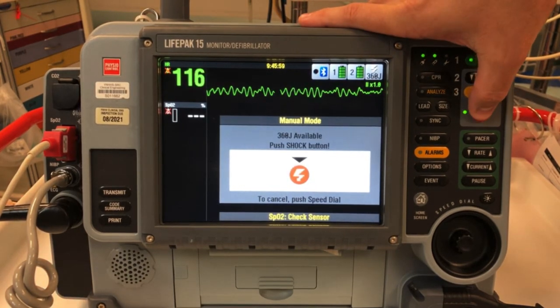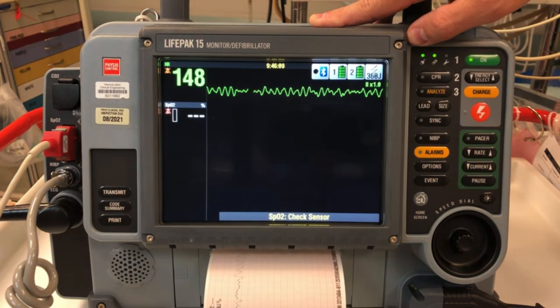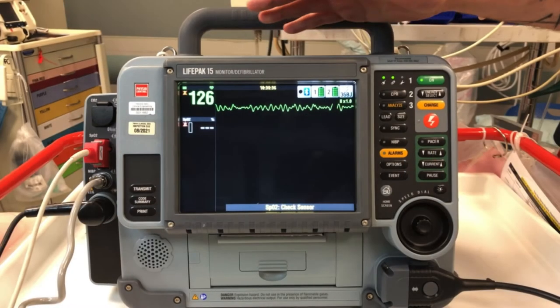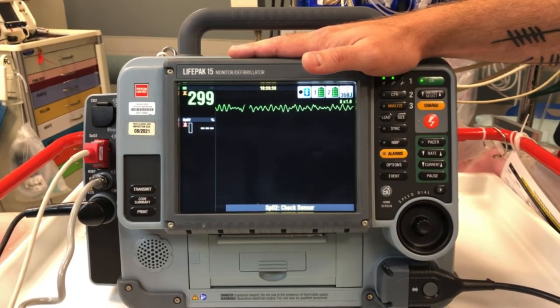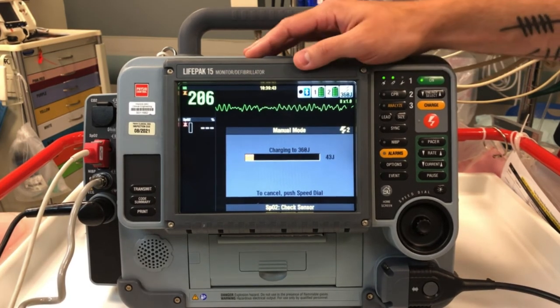Push the shock button below. Shock. And resume CPR. If you wish to charge your LifePak 15 seconds before the end of CPR, you will charge your machine.